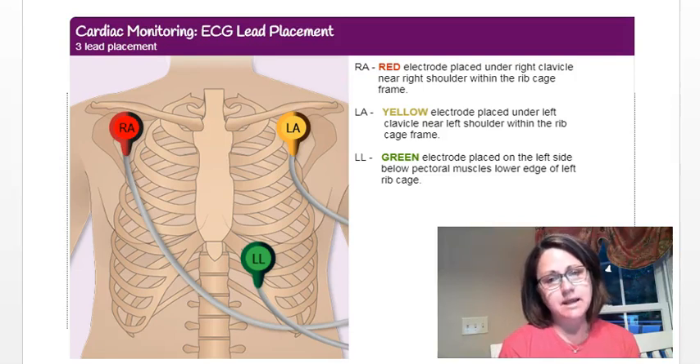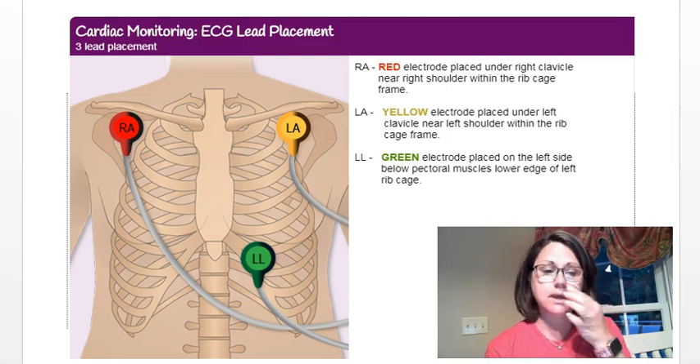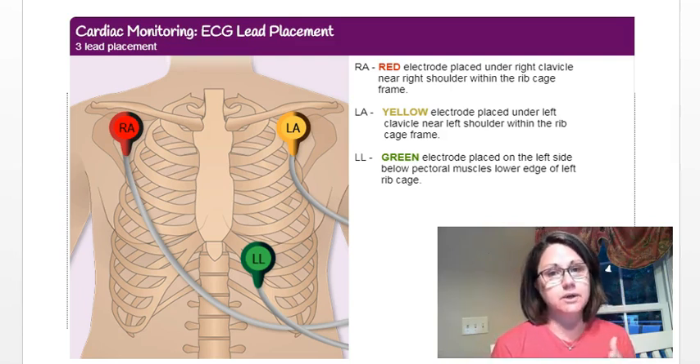Hi guys, I'm back with a short clip on how to set up your EKG so that you can read your own heart rhythm. You have three leads in your kit — they should be red, yellow, and green.